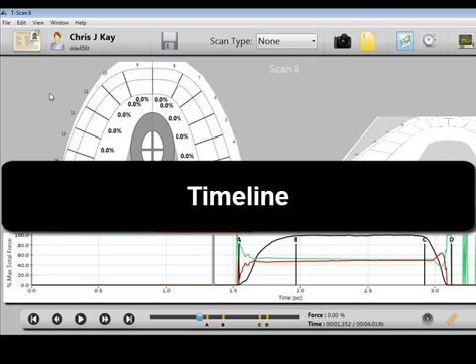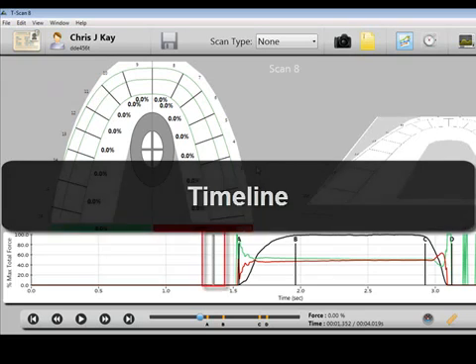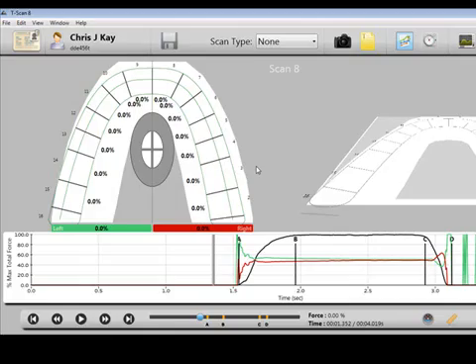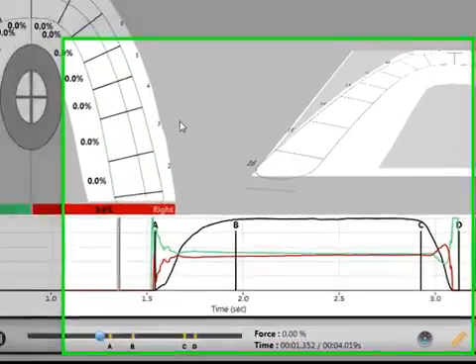Timeline. The timeline is a thick gray line that acts as a time indicator and can be moved to any location within the graph. This allows you to jump to any point in time during the patient's bite and view the force at that time.